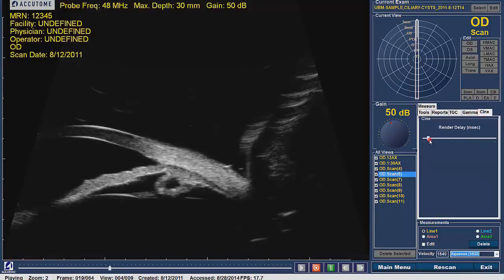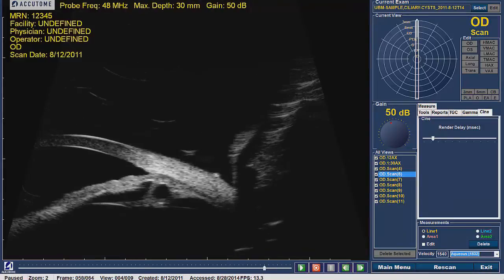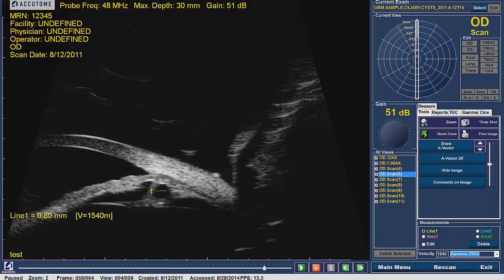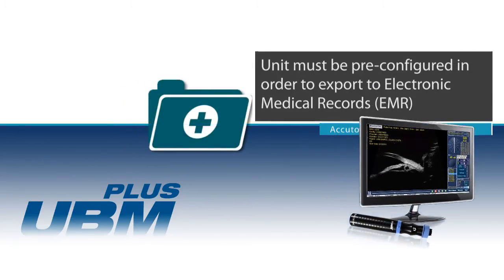Within the Analyze screen, choose the scan or view and replay the movie. Stop the movie clip on the desired image needed to export. Once the movie clip is paused, add any comments, measurements, and labels. This information can be saved as an image by clicking the camera icon located under the Tools tab. This image is now automatically saved and can be exported to the Accutome file folder on the desktop or to electronic medical records if the unit is set up to do so.